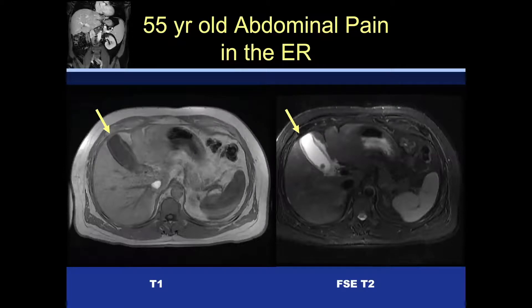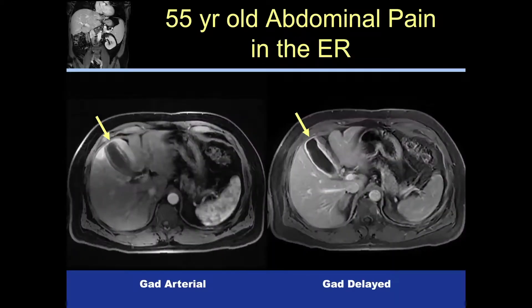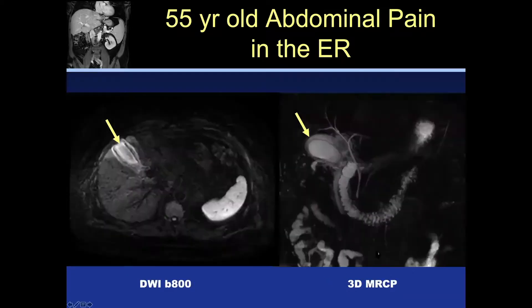Here's a clinical case: a 55-year-old came into the emergency room with upper abdominal pain. T1 and T2 images show an abnormal gallbladder and a gallstone. Early and delayed post-gadolinium imaging shows enhancement of the gallbladder wall. Diffusion-weighted imaging with a B value of 800 demonstrates a line of restricted diffusion representing the gallbladder wall.